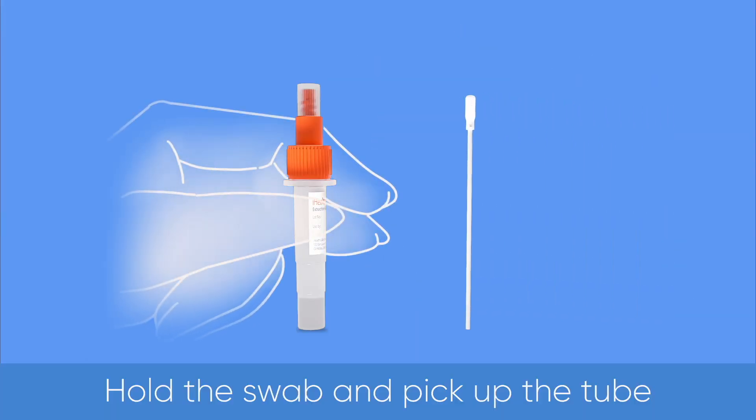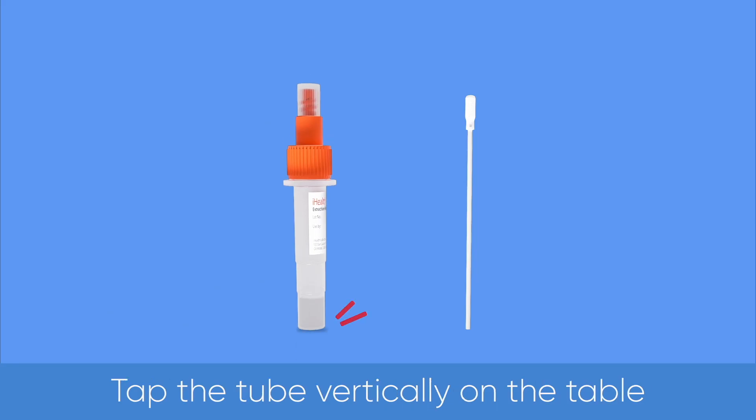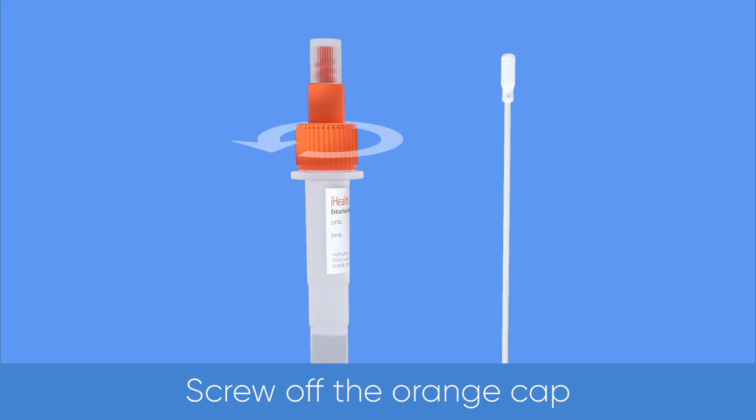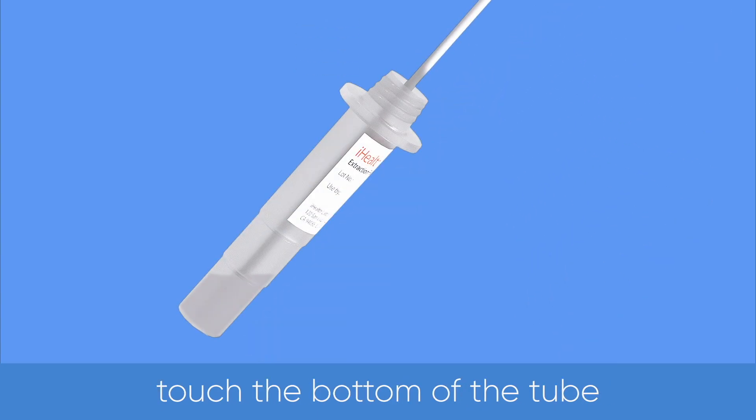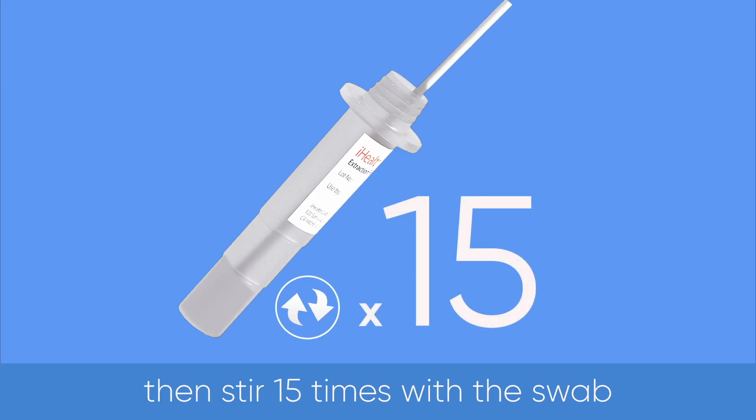Hold the swab and pick up the tube. Tap the tube vertically on the table. Screw off the orange cap. Place the swab into the tube, making sure the head of the swab touches the bottom of the tube. Then stir 15 times with the swab.